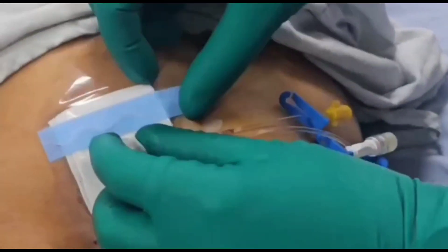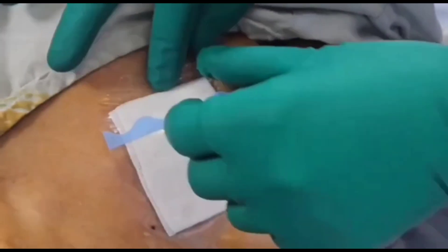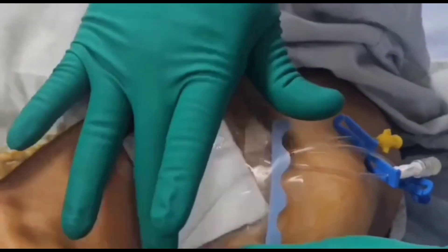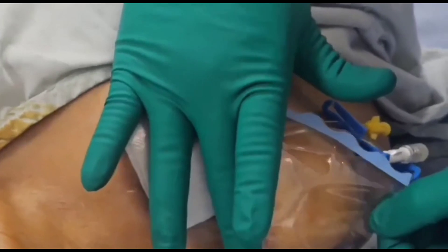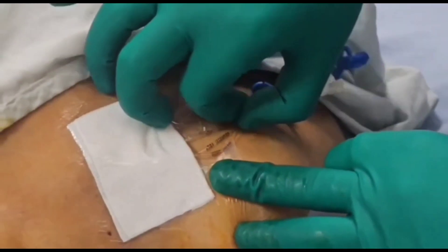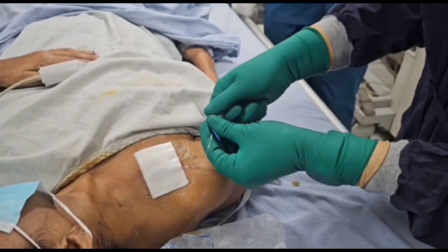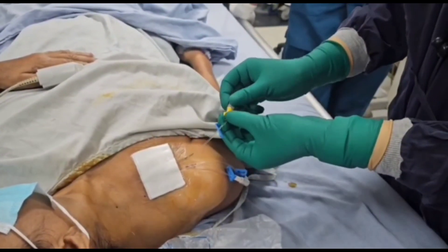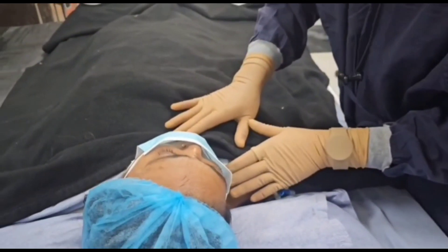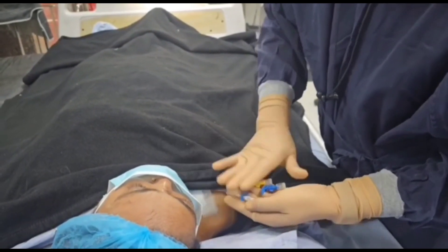Then we apply dressing over the puncture site for sterility and to protect the central venous line. After dressing, we counsel the patient about the central venous line and how to care for it. As the patient is bedridden, this is done at the bedside, and the doctor is seen counseling the patient.